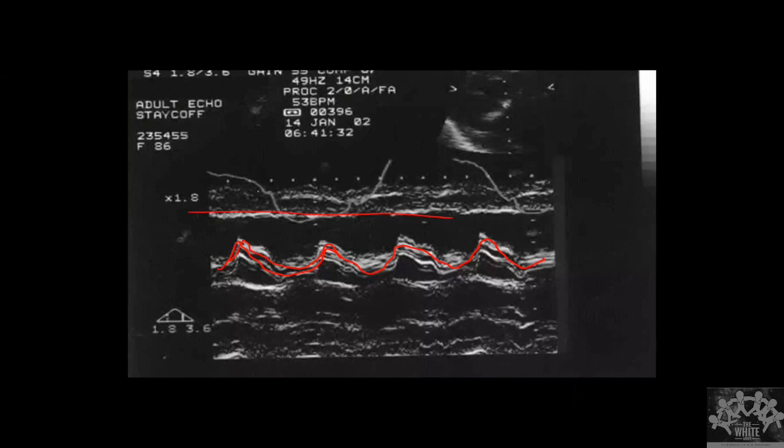Above it, if it is passing through the heart or something, it shows straight lines. If there is slight motion, it will also show slight motion. Sometimes when we measure the heart, the entire heart is also moving, right? So it will also show small waves. But the mitral valve will show the maximum movement. That's how we identify: small waves, fine; a large wave, mitral valve.